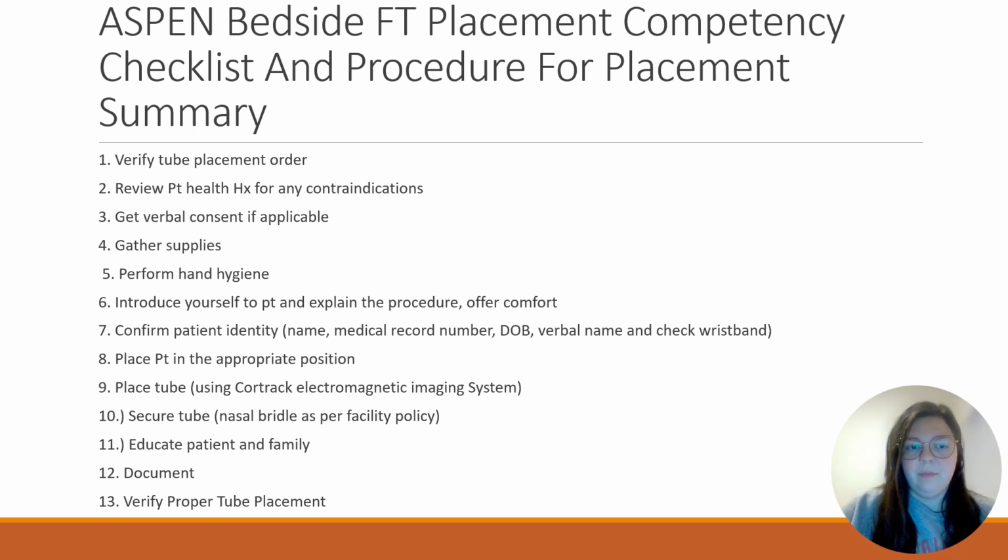You should place the patient in the appropriate position for the procedure, trying to make the patient as comfortable as possible. And then you should place a tube based on the protocol that you're using, in this case, the CORTRAC electromagnetic imaging system, which uses electromagnetic receivers to visualize the tube as it's being placed at bedside. Once the tube is placed and you have a visualization, you should secure the tube.